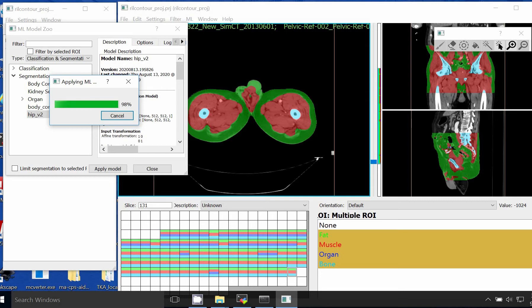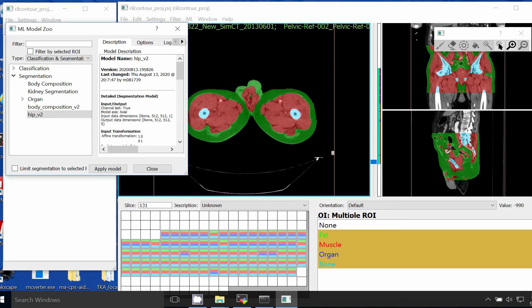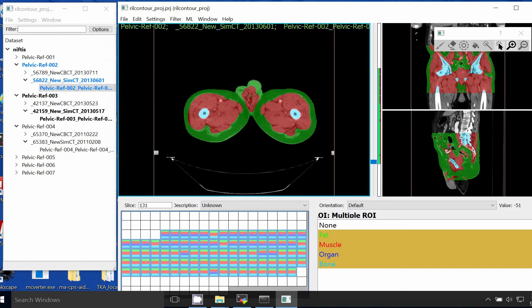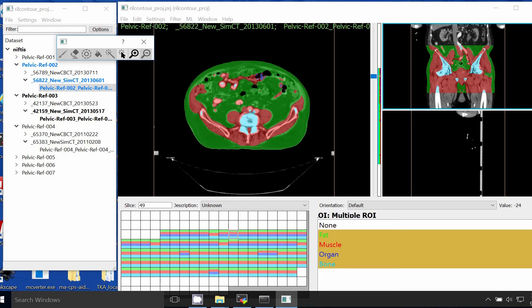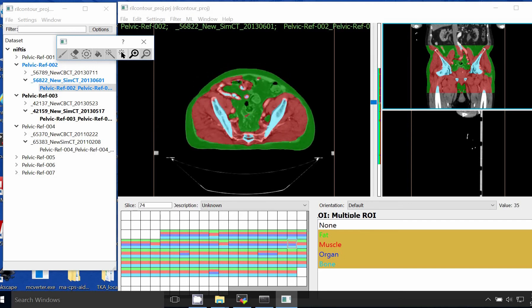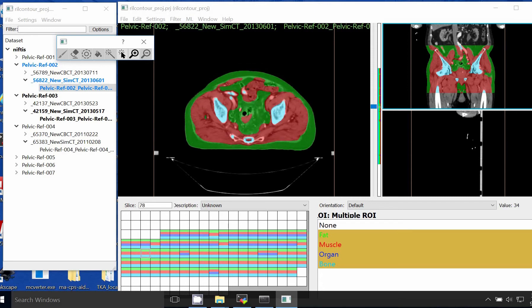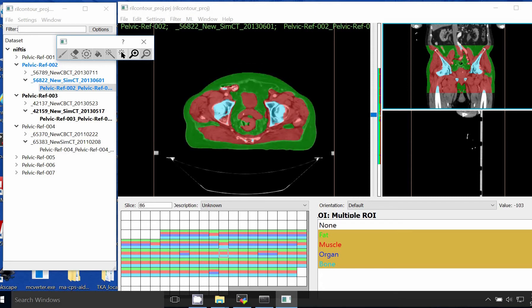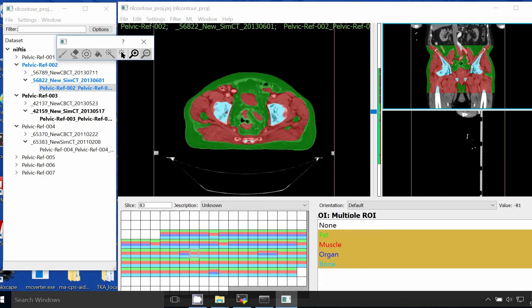Just finishing up segmentation here. So now we can close out of the ML menu. You can see the model segmented fat in green, muscle in red, bone in light blue, and organ or soft tissue in dark blue. Organ is sort of a catch-all category — any anatomy that doesn't fit into the other three categories we're going to segment as dark blue. The model's doing a pretty good job with muscle and fat, but you can see there are some corrections that need to be made to the bone and organ. A lot of this organ is getting missed, so we'll go ahead and start with corrections.